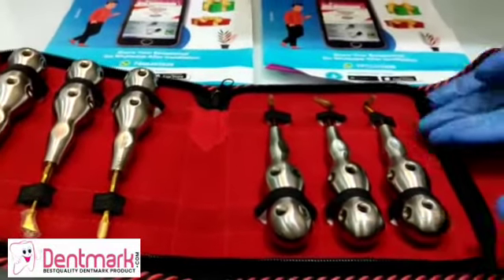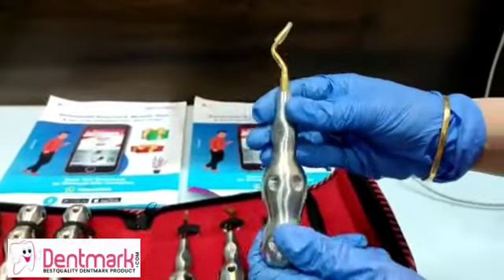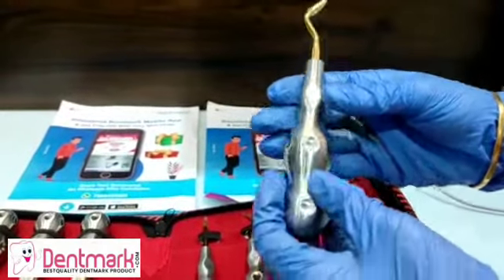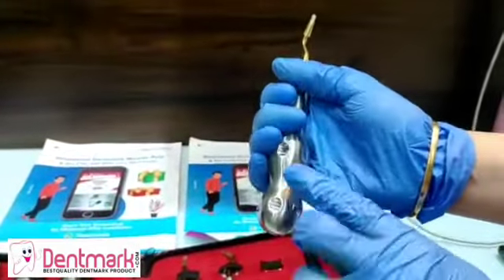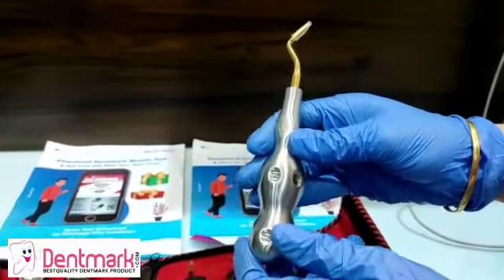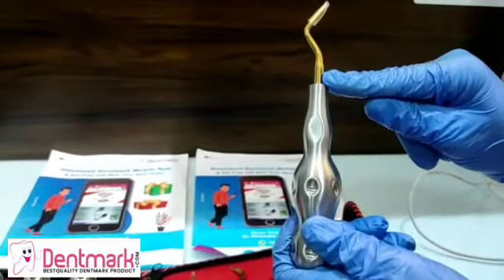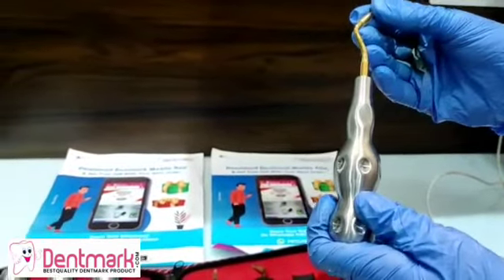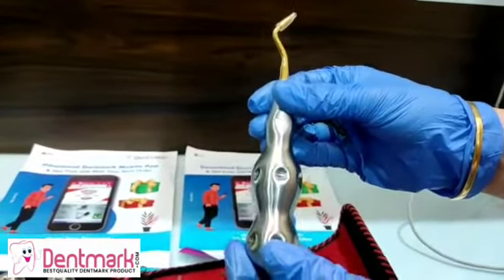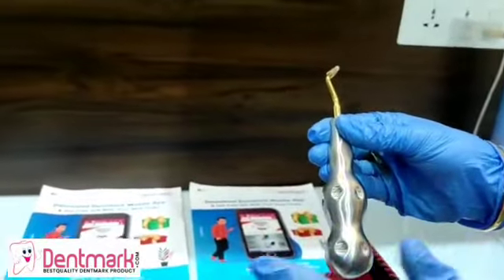The body of these pieces is made up of French stainless steel, which is corrosion resistant and rust free. The grip is very comfortable, so the operator can function properly. This is made up of titanium nitride coating, and it is autoclavable. These can also be cleaned in the ultrasonic cleaner.